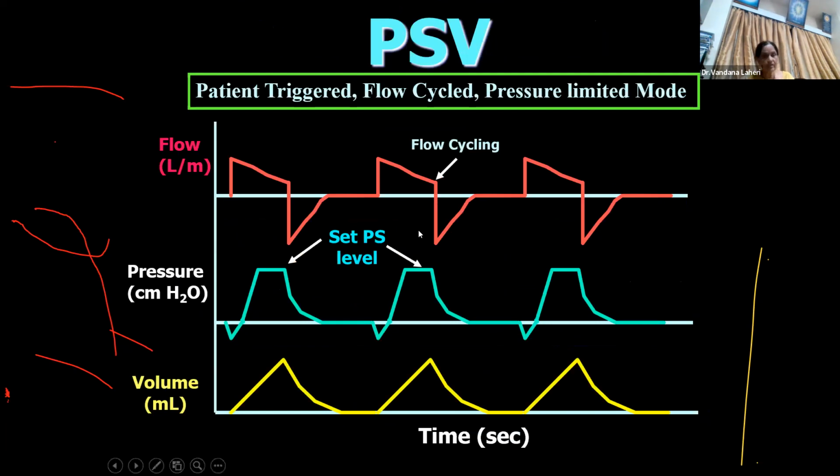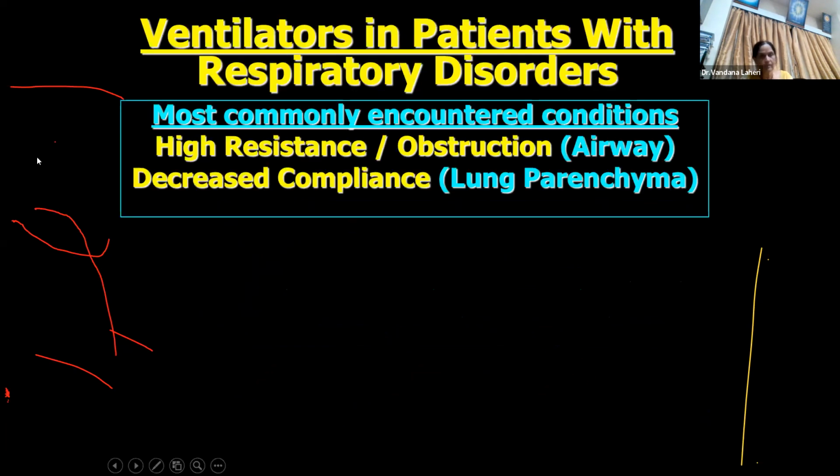This is PSV. Can you see each breath is triggered by the patient? There is no mechanical breath. This is a pressure supported spontaneous breath.